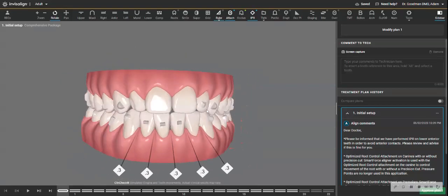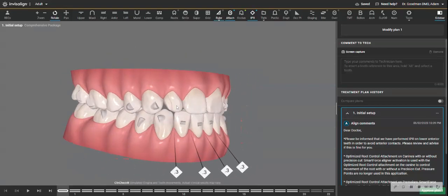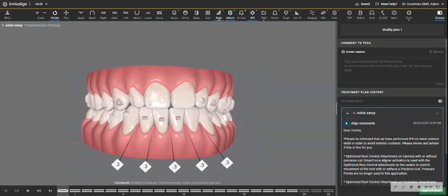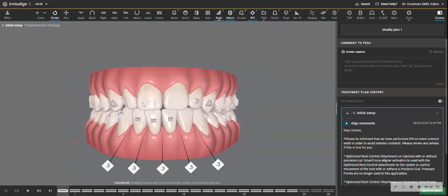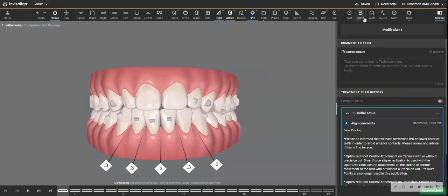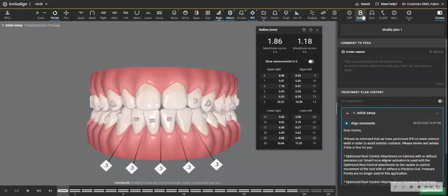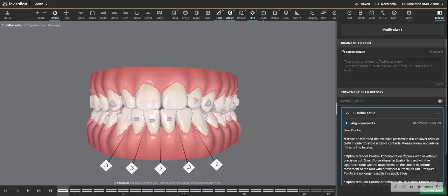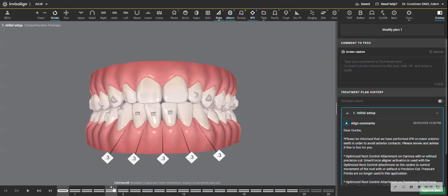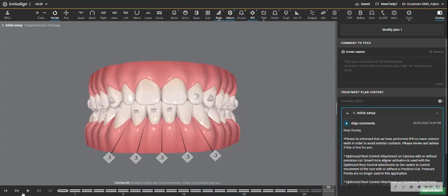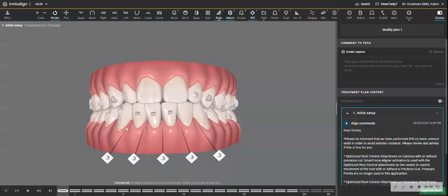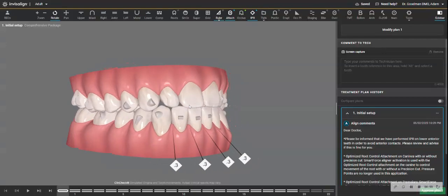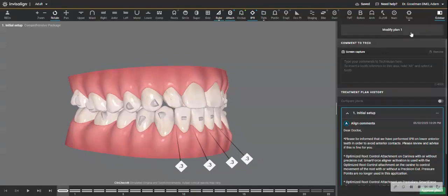You can even check here on the Bolton table, and there you see a mandibular excess of 1.86. So that's quite a large Bolton discrepancy. That's why the ClinCheck comes back with IPR on the bottom. But I'll tell you how I would approach this case. I'm going to modify now.